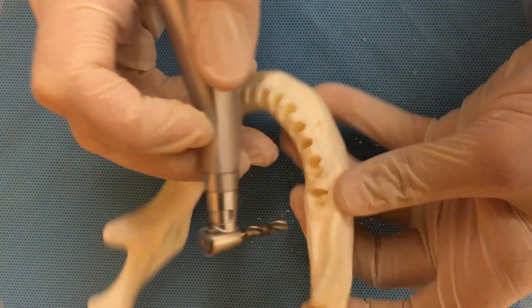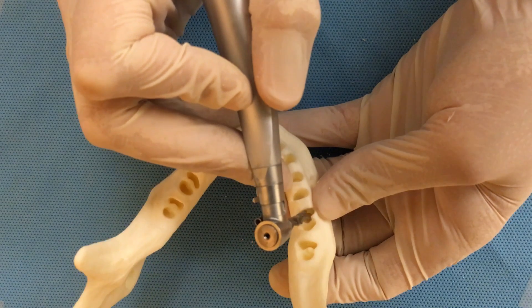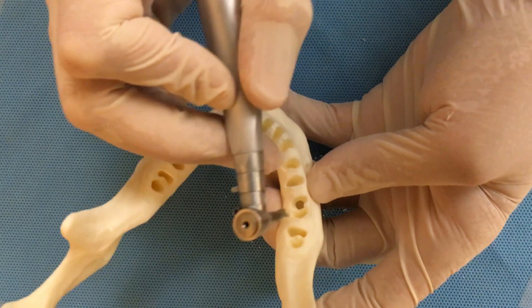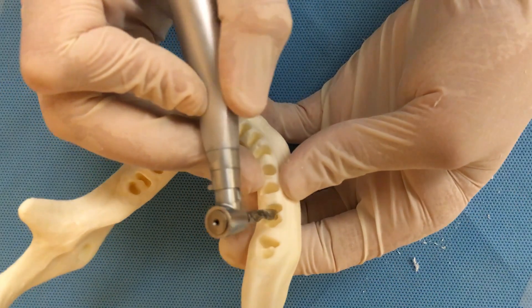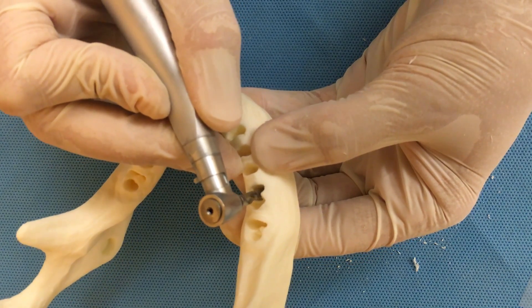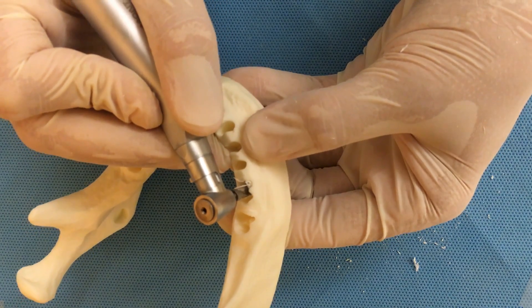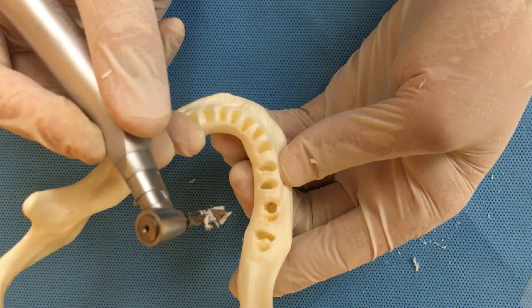At this point we can drill at 1200 RPM, or we can drill slower and collect the bone particles without irrigation — then mix them afterwards with bone graft. It's up to you whether you'd like to drill and then graft, or mix with some bone particles. You must not irrigate and no suction when drilling slowly so you can collect bone particles. You can mix these particles with the bone graft for much faster healing.